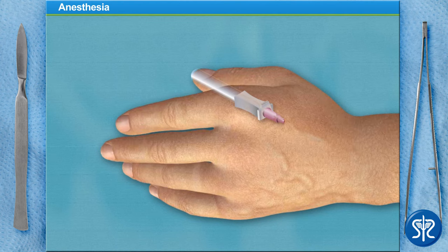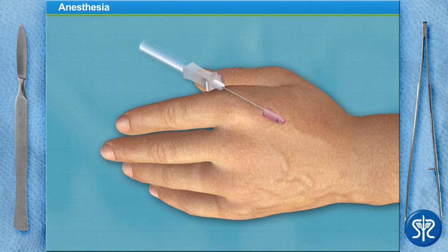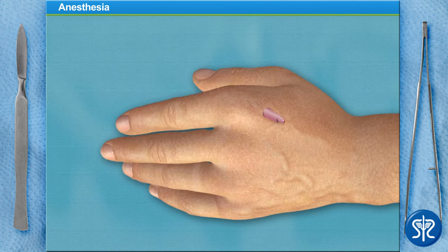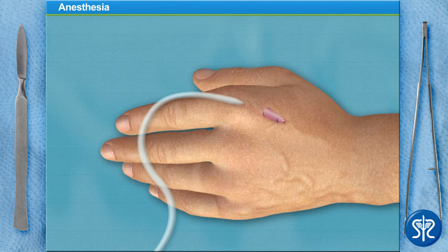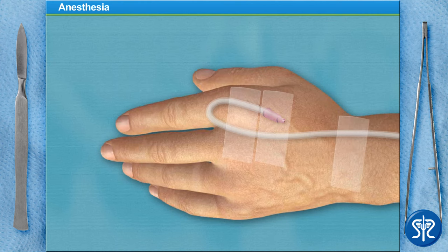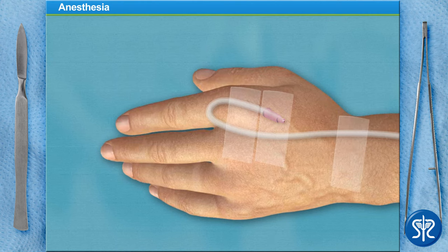While placing a small amount of pressure over the vein to collapse it, remove the needle. This will reduce the amount of blood that may discharge out of the angiocatheter when the needle is removed. Now that the needle has been removed, I'll dispose of it in a sharps container. We need to secure the IV with tape and test the line. Now we'll wait a few minutes for the anesthetic to take effect.